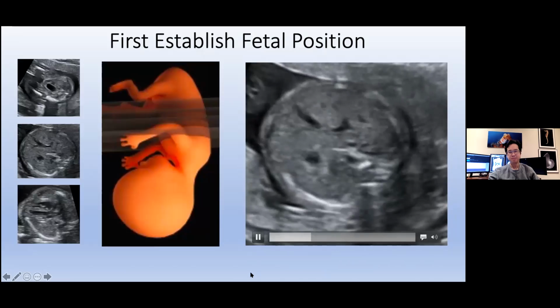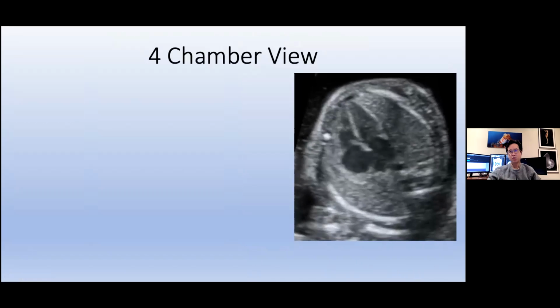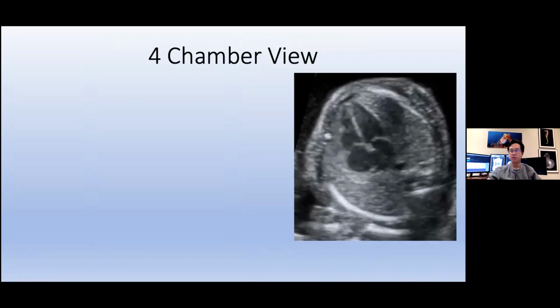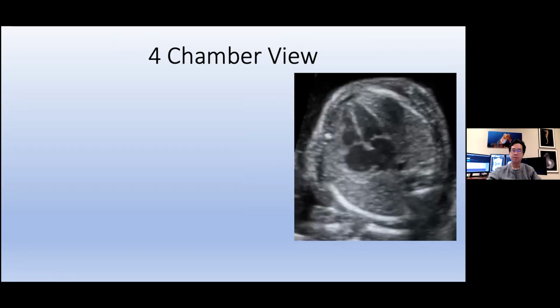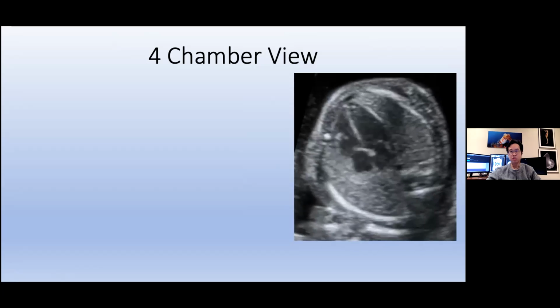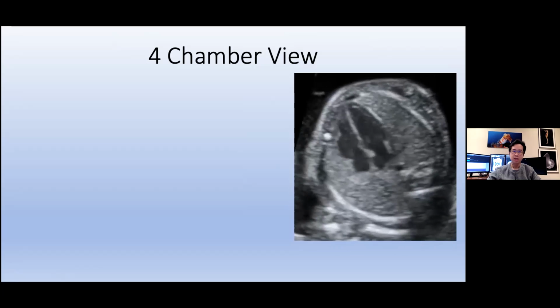Okay. So we'll move back into the chest. This is where we don't do any fetal biometric measurements of the chest, but there is a very important series of images that you want to take or evaluate. And one of the most important ones, of course, is to evaluate this 4-chamber image of the heart. There are several images of the heart that constitute a full fetal anatomic survey. The cardiac 4-chamber view is an important one of those.